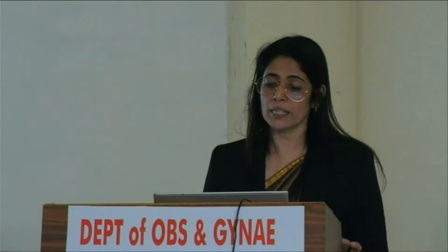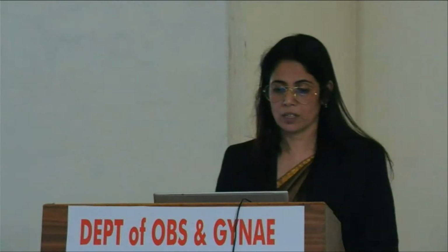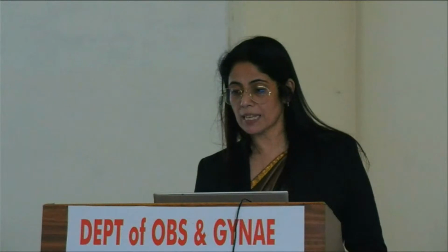So documenting this RNT, the retronasal triangle, is very important, because first we can look at any gap in this palate, in the maxilla, and also we can document micrognathia or retrognathia by seeing that the mandibular gap is absent. So this is what I was talking about, the retronasal triangle. And in case of micrognathia, we see that this mandibular gap is absent.